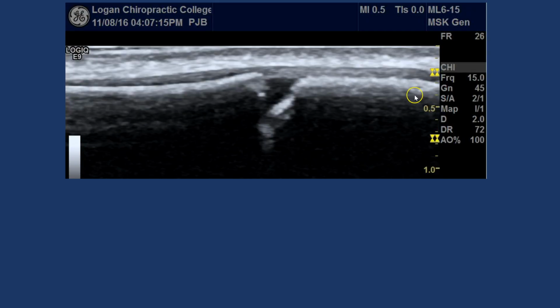We can see periosteum quite nicely on our ultrasound exam. Here's a pediatric fibula, distal fibula. This is the growth plate here. This is the lateral malleolus and the distal fibular shaft, and all of this anatomy here is periosteal anatomy as it drapes over. Again, rich osteogenic potential. This is why kids can heal quite nicely. This is also why kids get aggressive periosteal reactions when there's underlying bone pathology, because of the rich osteogenic potential here.